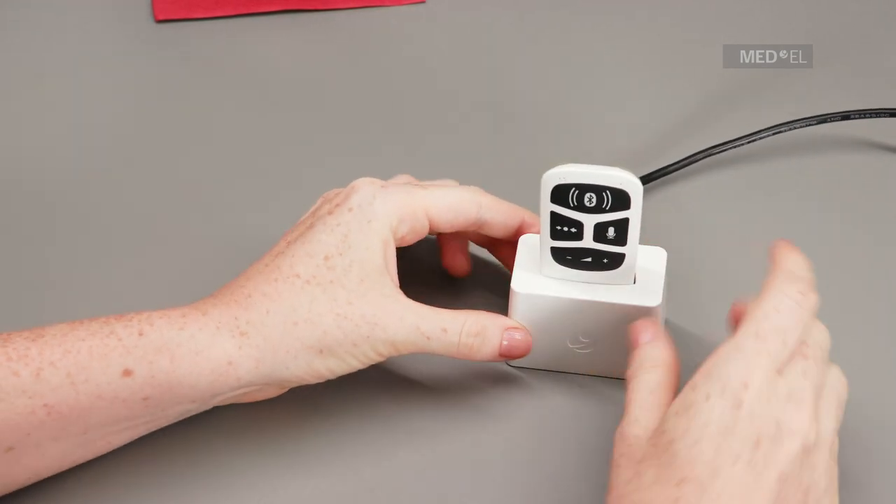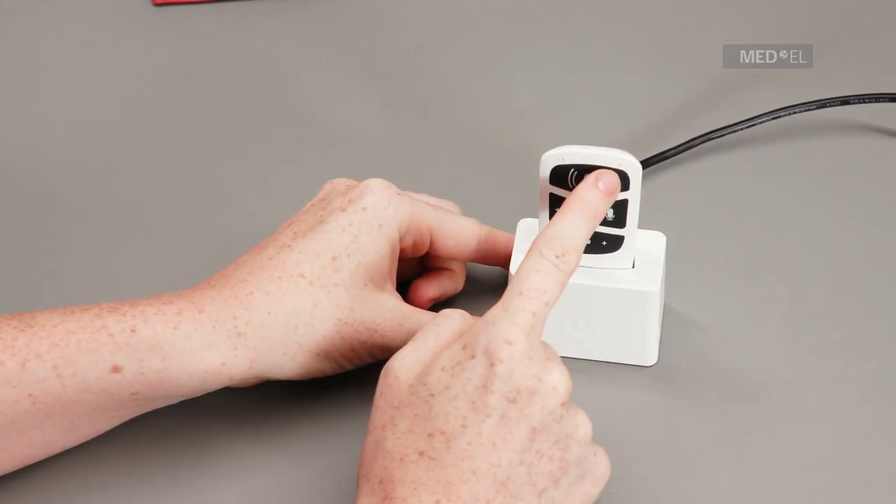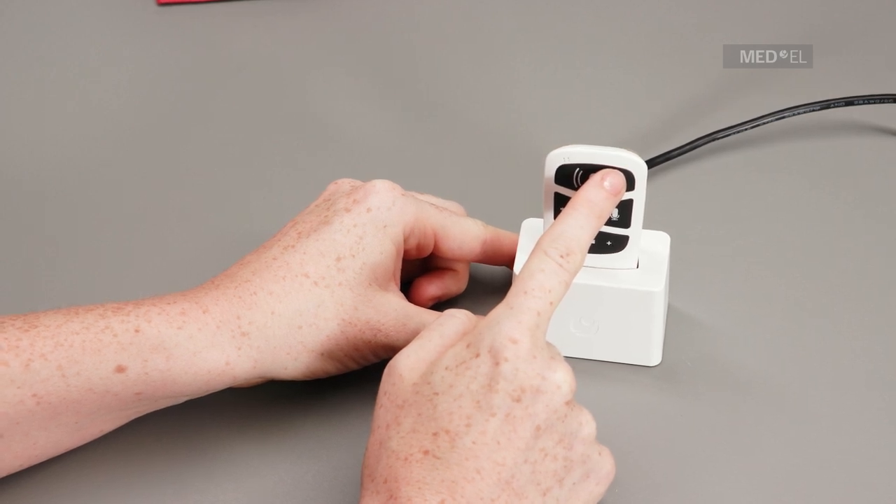The status light will be orange while AudioLink is charging. When the status light turns green, AudioLink is fully charged.